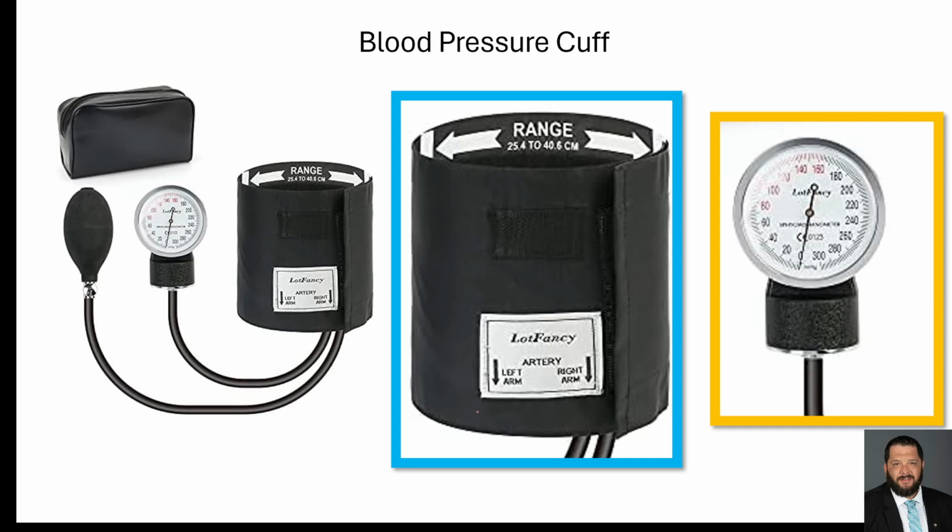It's comprised of a couple of different pieces. You have the inflator here, or a bulb. You have the gauge that tells you the pressure inside the cuff. And then you have the arm band of the cuff. The arm band should be appropriately sized for your patient. You can see where it should rest over the artery, so it's placed on the upper arm. If you're on the left arm, this arrow here that says left arm should be placed over the brachial artery as it comes across the antecubital fossa. Likewise, on the right arm, you should place the artery at that arrow.